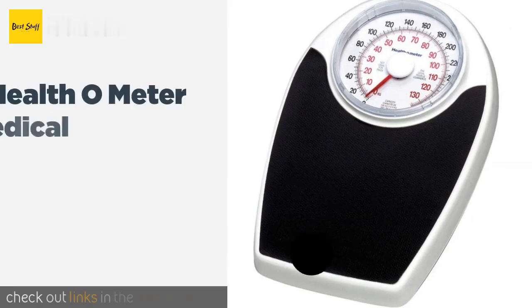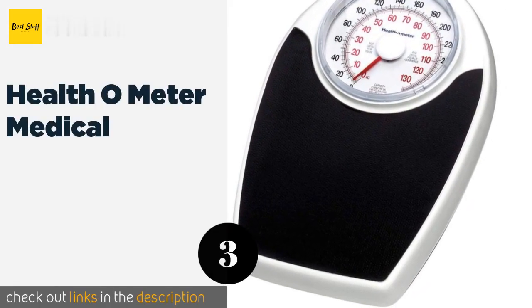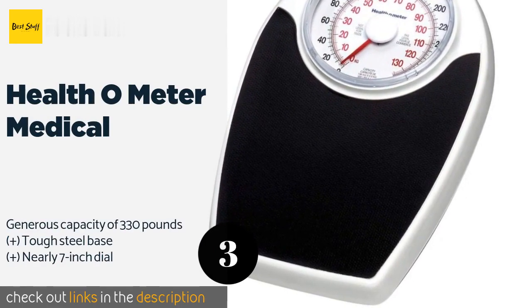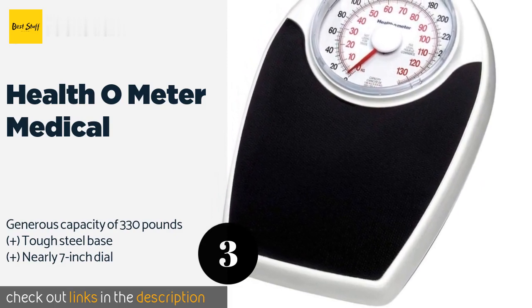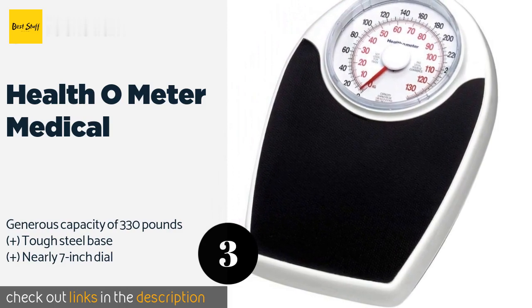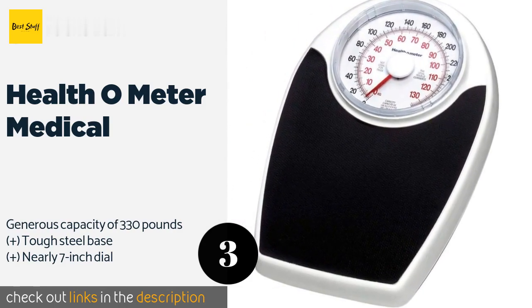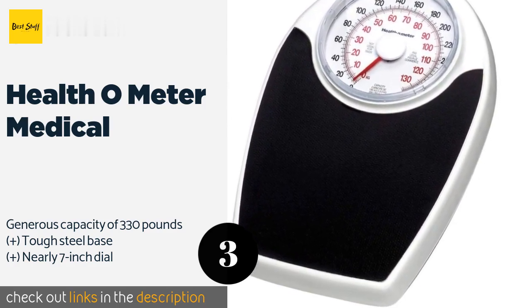Number three is the Health o Meter Medical. The last thing you want to do is trip when you're trying to record your weight — a problem the Health o Meter Medical helps you avoid with its relatively low 2.25-inch high platform. It offers pounds in black numbers and kilograms in red, making it a snap to read. This product is available on Amazon for $55.